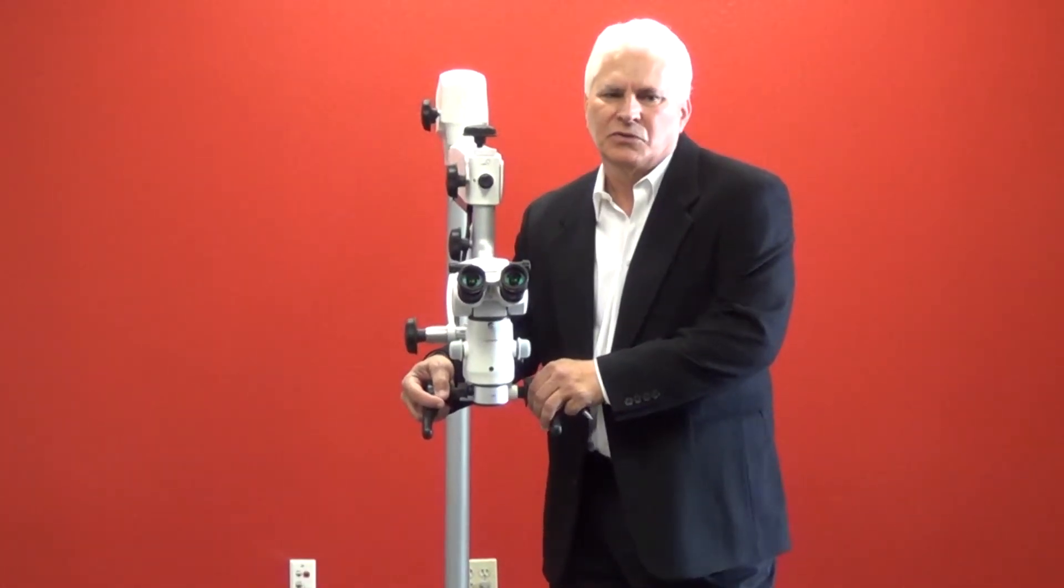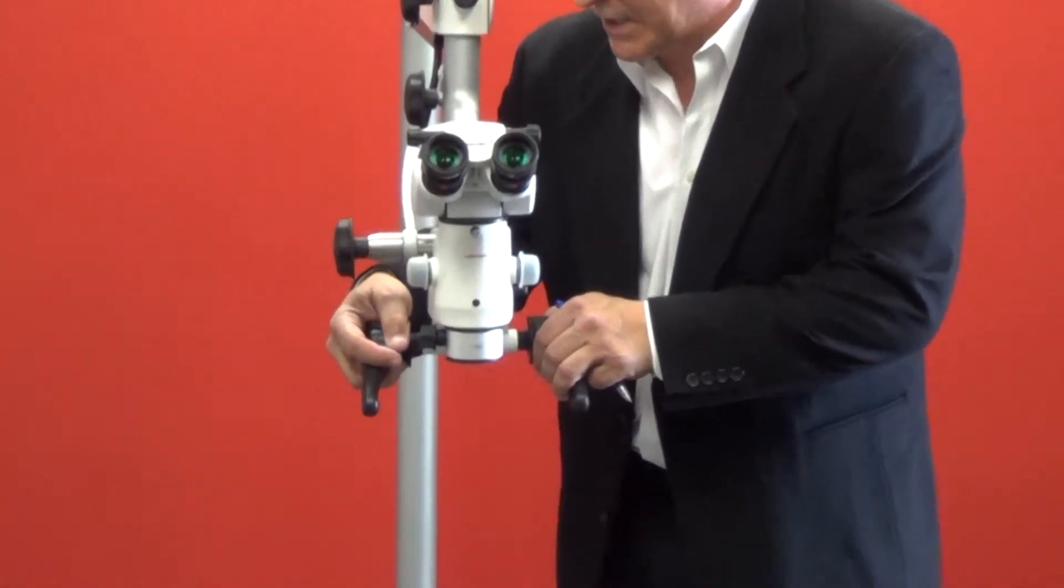The ergonomic handles can be adjusted by pulling them out and away from the microscope and rotating them to the ideal position like so.